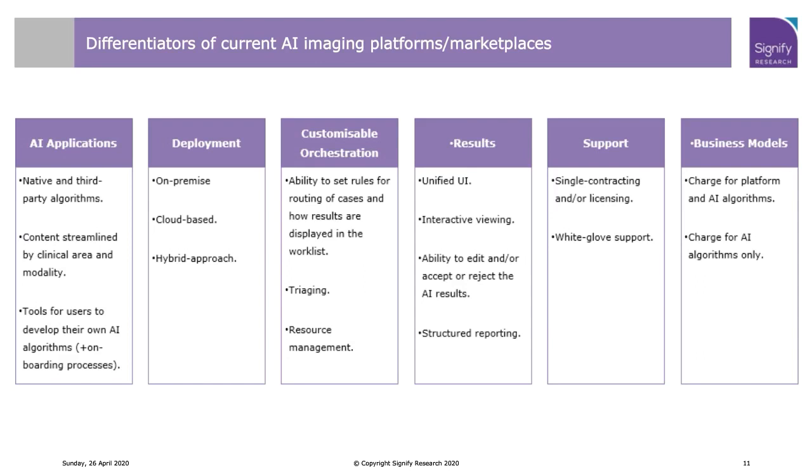Customizable orchestration. Can the user set their own rules for routing the case? And does the platform have the ability to triage cases on the work list? How will the results be displayed? Will they be provided in a unified user interface? And will the radiologist be able to interact with the findings? In terms of support, what level will be provided by the vendor? And will this be hands-on support?